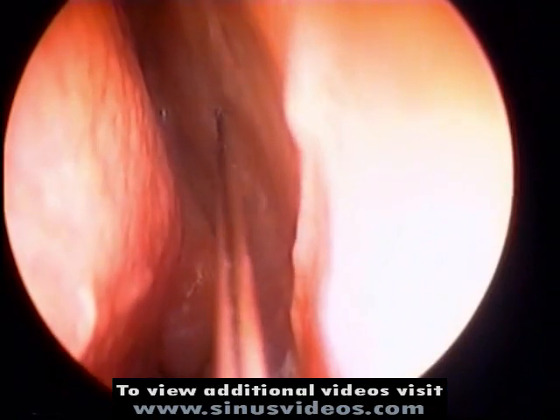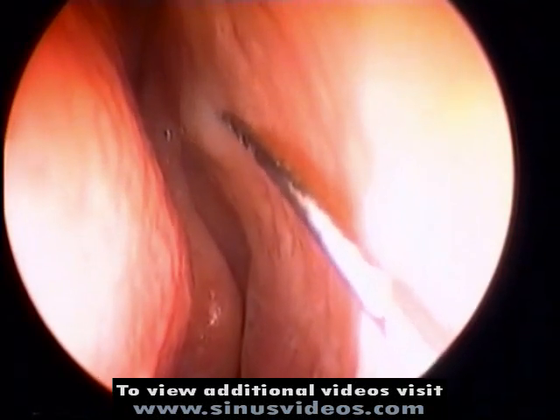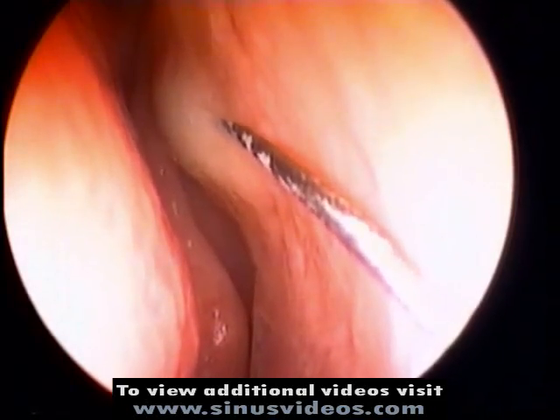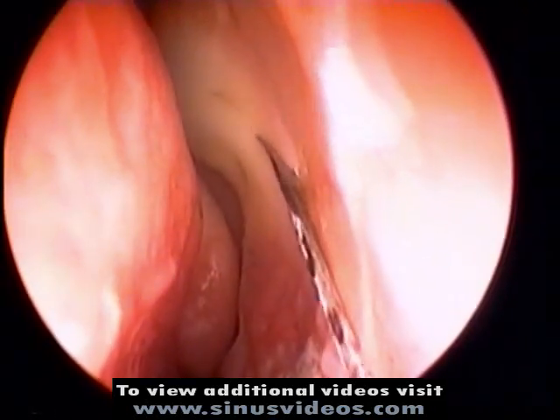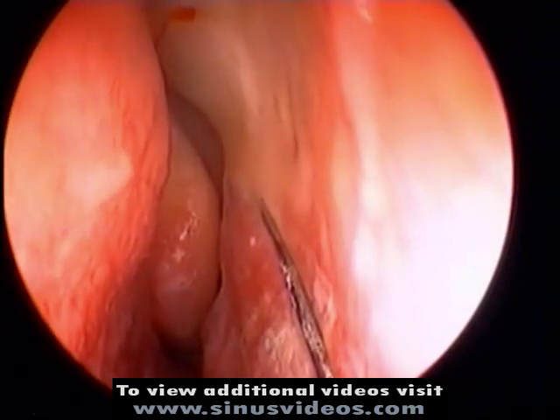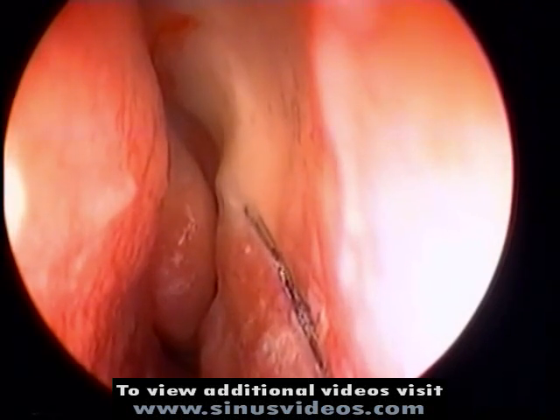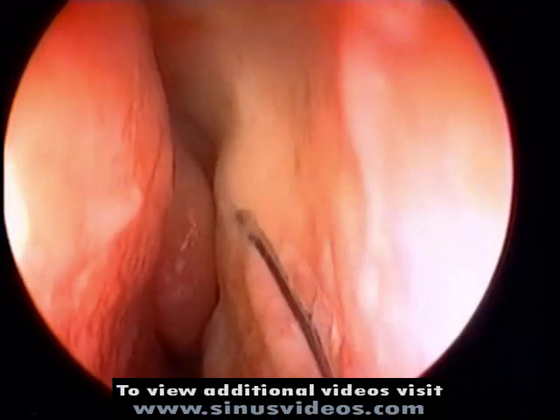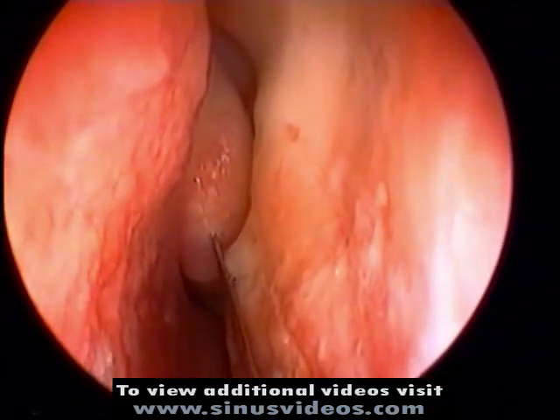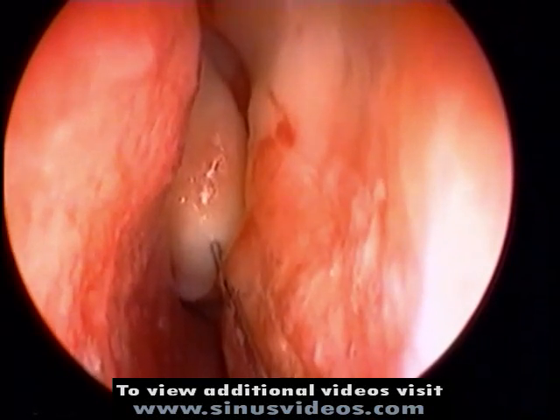Endoscopic sinus surgery begins with submucosal injections of a vasoconstrictive agent, in this case 1% lidocaine with epinephrine 1 to 100,000, along the lateral nasal wall. The initial injections are placed just anterior to the maxillary line, which represents the junction of the ascending process of the maxilla with the uncinate process.